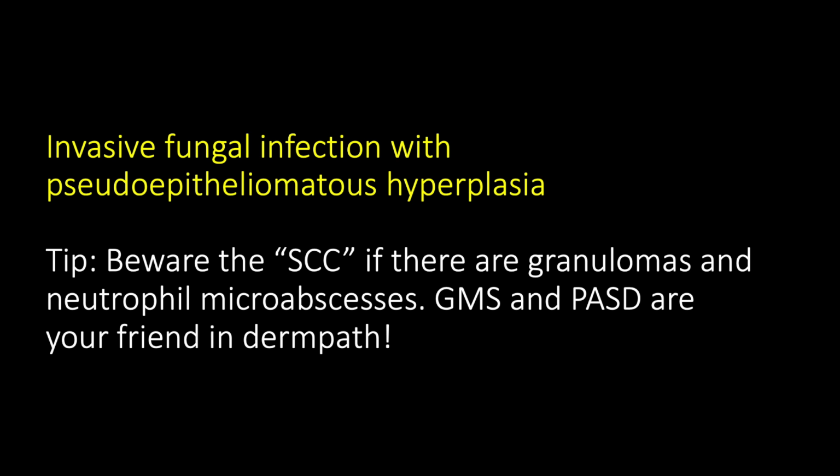I've generally used PAS, although for invasive fungi, GMS seems to do better, and it just kind of depends on what stain works best in your lab, or if you have a high suspicion, you can do both. There are certainly times where I'm really worried about infection, and I'll do both stains, and I think that's fine. But yeah, always keep that in mind.